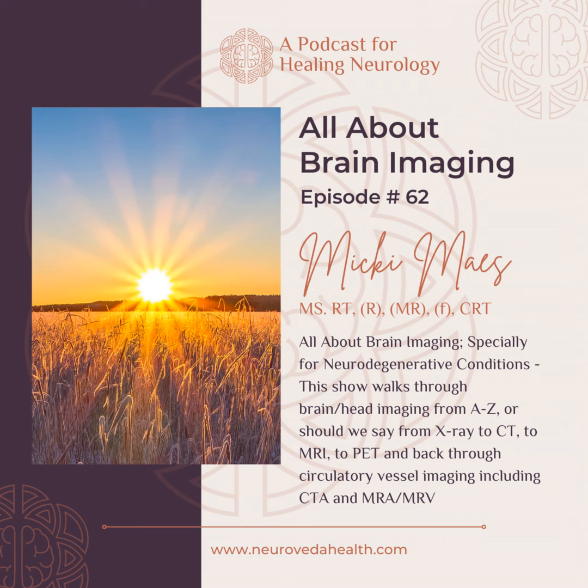So generally, for a neurodegenerative brain process like MS, we would be doing a T1 weighted scan. And it's a whole set of physics where in T1, fluid is going to be dark, in T2, fluid is going to be bright. So it allows us to look at the body tissues in different ways.